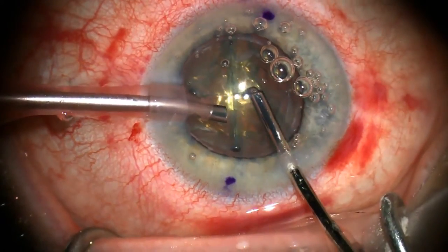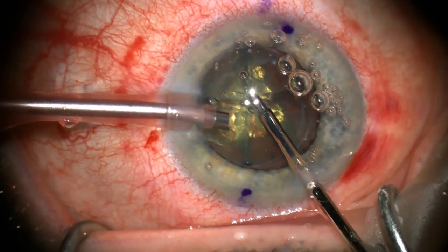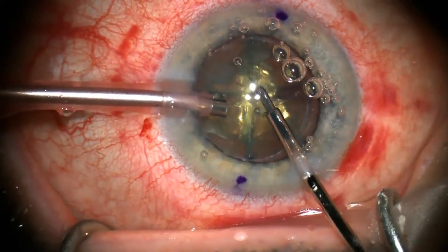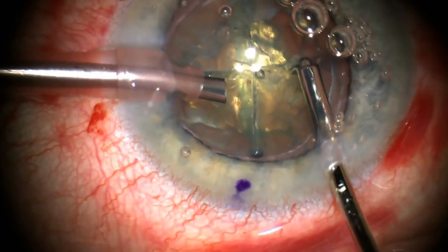This is Steven Slade narrating a new video on laser cataract surgery. Here you can see the nucleus already pre-chopped with the laser. The divisions are evident in a cross pattern.